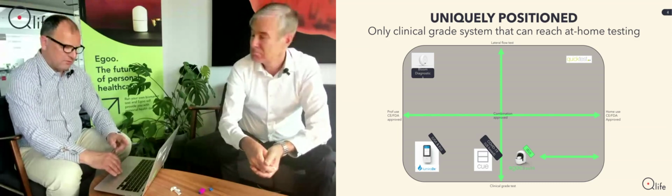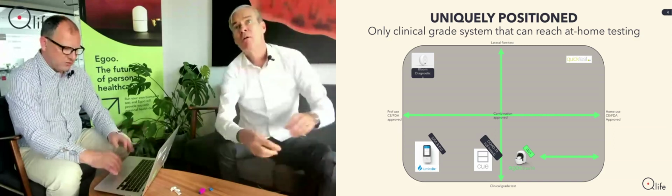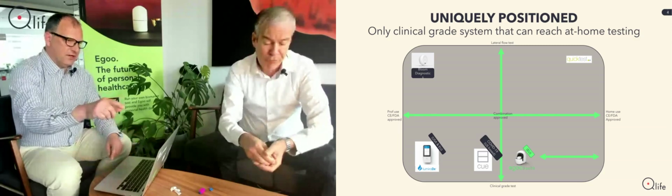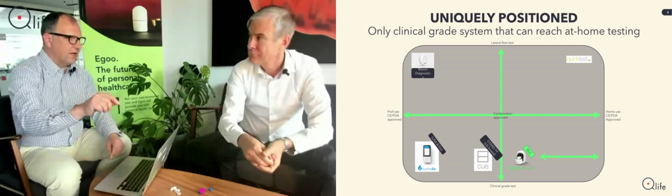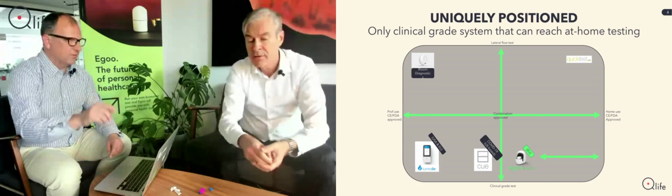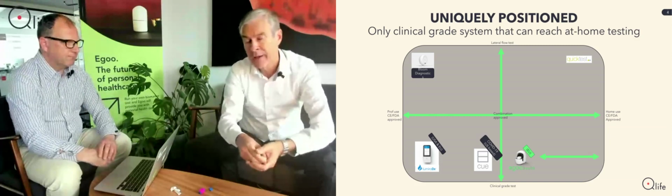So, should we take some questions? Yes, let's do that. You described a little about the unit. There's a question about the assays again. Can you test for several indications in the same assay? We can, as a matter of fact, but there is a limit to how many we can test. We can test 2, max 3.